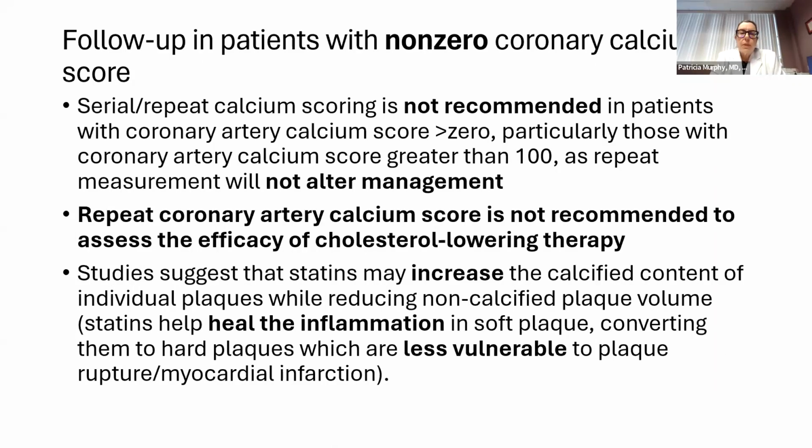So, following up. Serial or repeat calcium scoring is not recommended in patients with calcium scores greater than 0, particularly if it's greater than 100, as repeating that test will not alter your management. And repeat coronary artery calcium score is not recommended to assess the efficacy of cholesterol-lowering therapy.